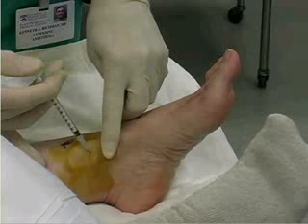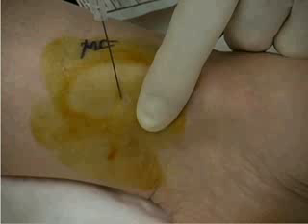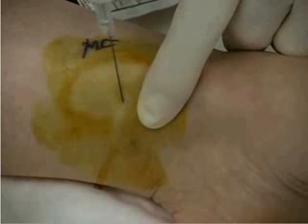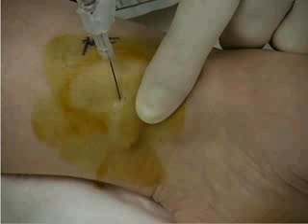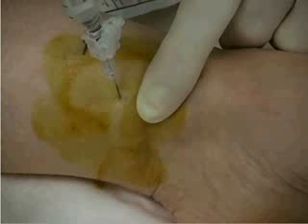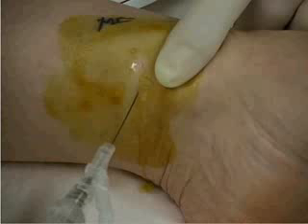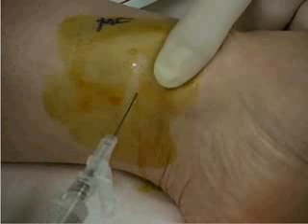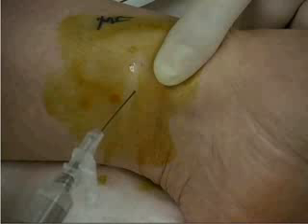Insert the 22-gauge needle through the skin wheal, directing the needle posteriorly toward the Achilles tendon. Inject 3 milliliters of local anesthetic. Reinsert the needle into the raised tissue and inject an additional 3 milliliters of local anesthetic anterior to the malleolus, appreciably raising the cutaneous tissue.